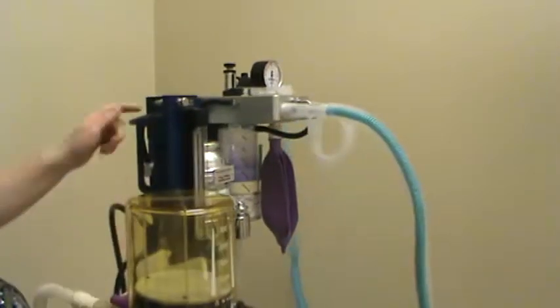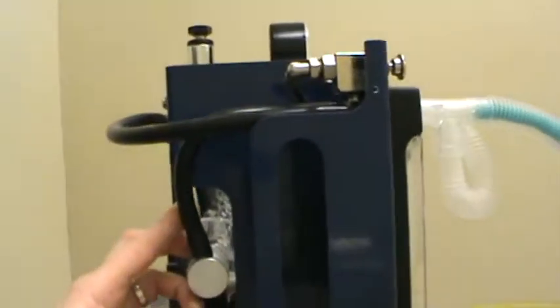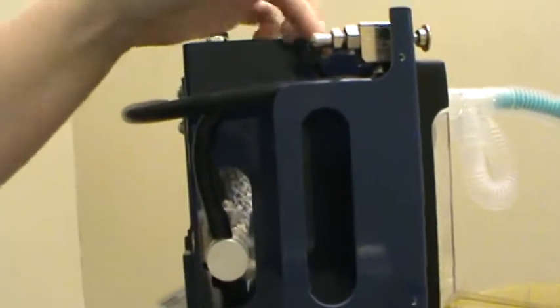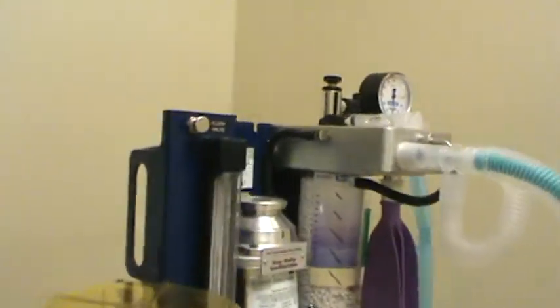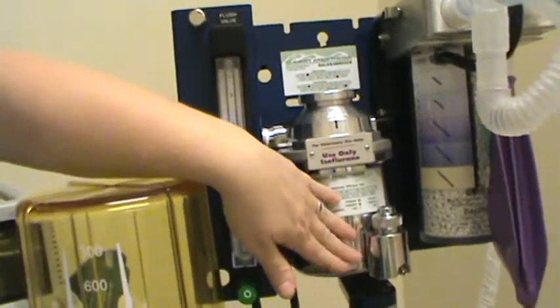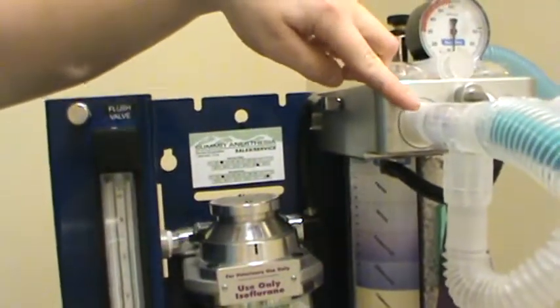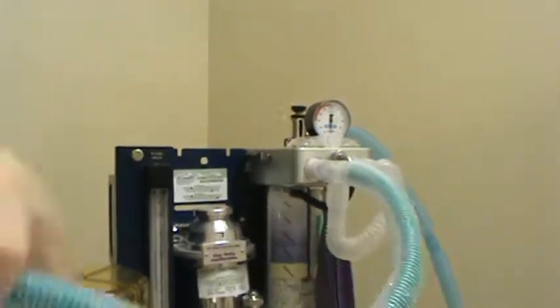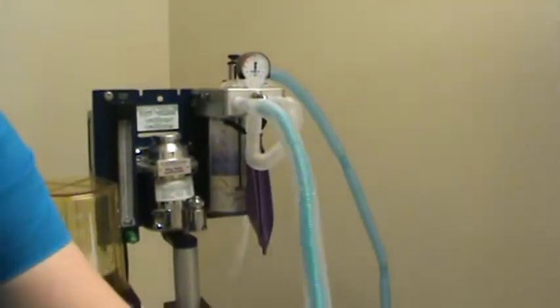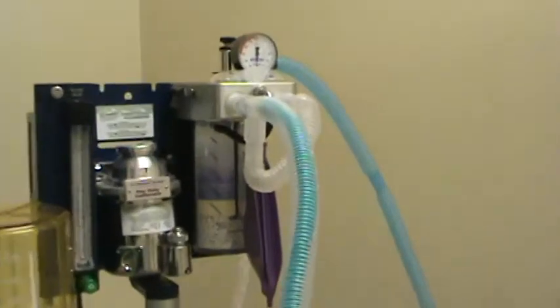From there it's going to go behind here. It's black on blue, so it's really hard to see. But from the flow meter it goes into here and will actually go into the vaporizer. It's going to collect the liquid gas anesthetic and go through this tube and into our unidirectional valve here, our tube, and then into the patient. The endotracheal tube would be connected here.